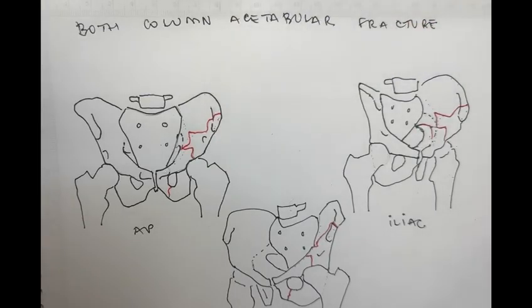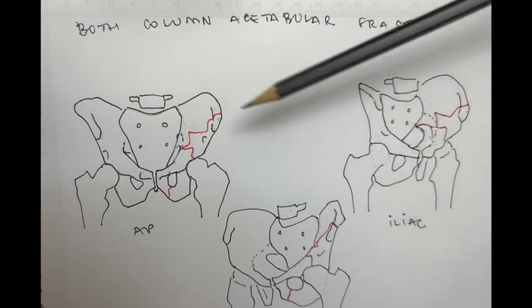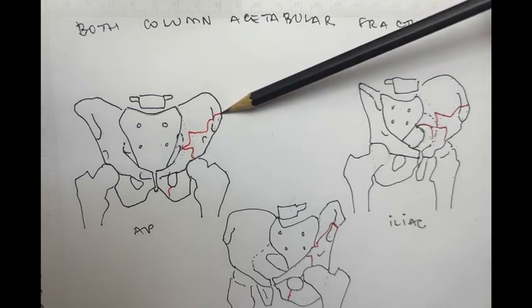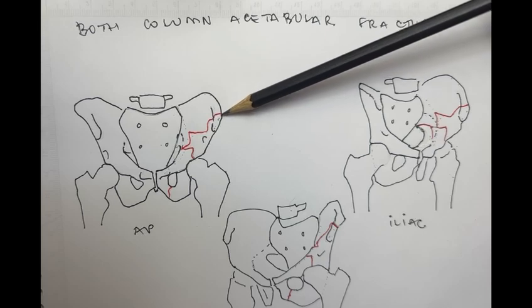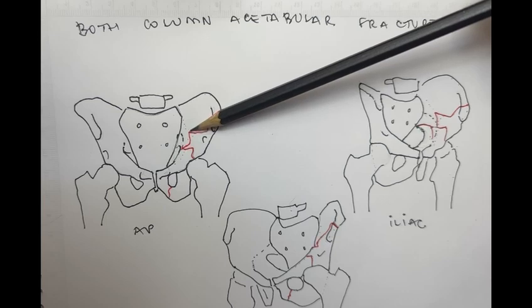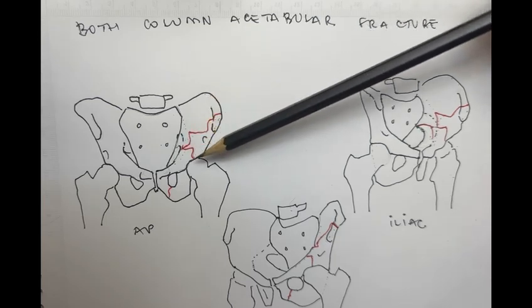So this is a both column acetabular fracture, and here we have the three views: the AP, iliac view, and obturator view. So on this view we can see the fracture coming from the iliac bone, iliac crest, going down to the iliac fossa, and then running into the inner pelvis.